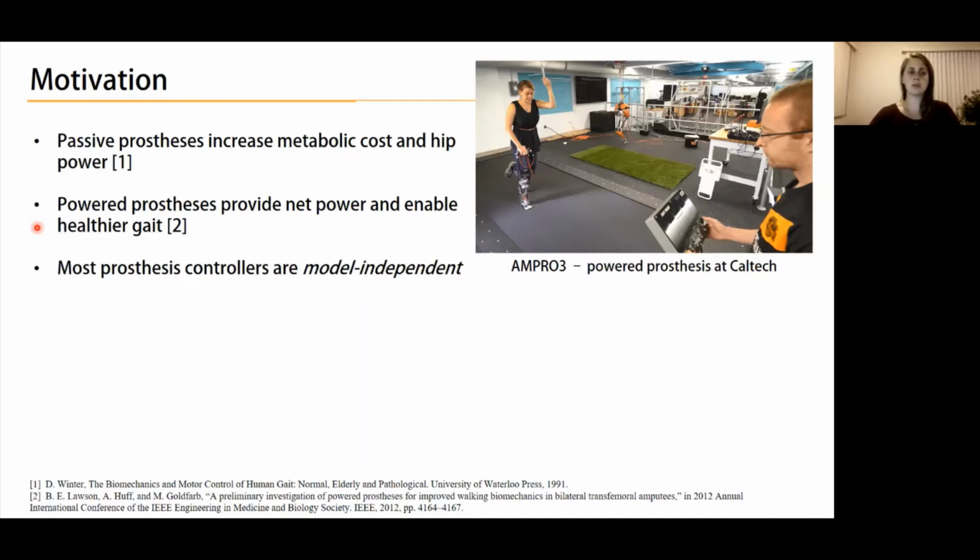Most current prosthesis controllers are model independent, meaning they do not account for the dynamics in their control method. This is because there is a human acting on the prosthesis and influencing its dynamics, but this human behavior is unknown, so the prosthesis dynamics are not fully known.